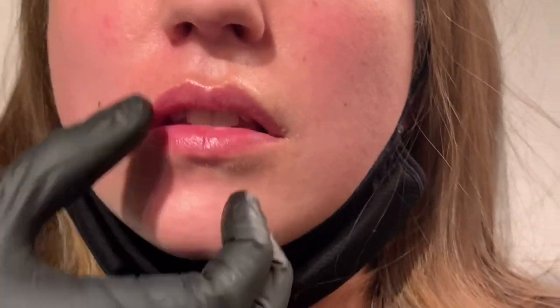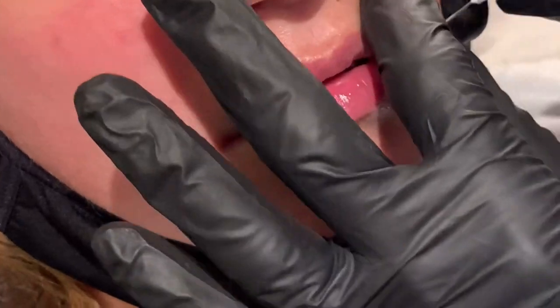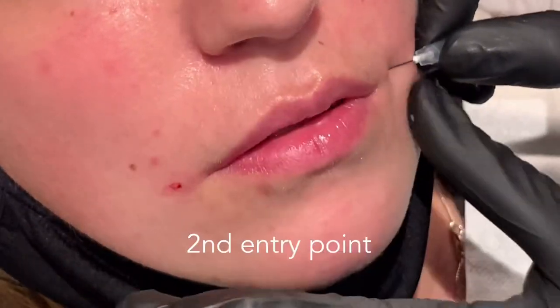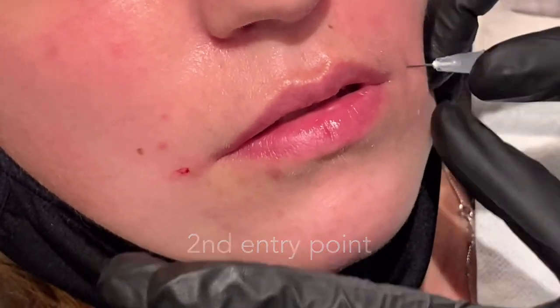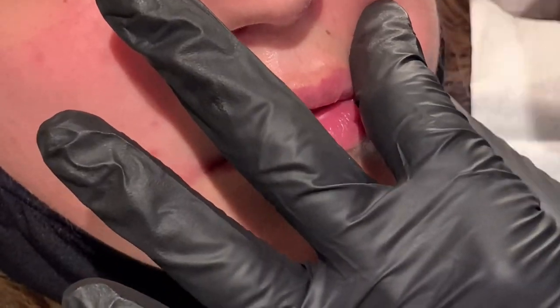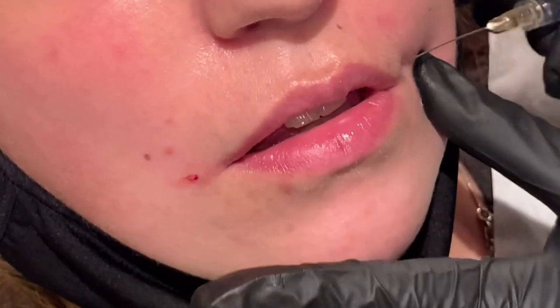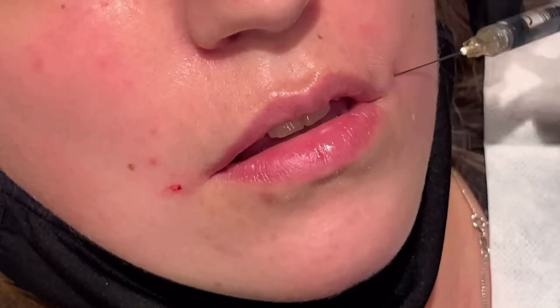The depth is really important here. Going too deep you're going to lose the product, and too superficially you're going to see the product. So you want to be in a subcutaneous plane — you don't want to see the color of the cannula, but you want to be just a bit deeper than that. Here I'm starting the other side, again within one centimeter of the oral commissure, and I do the exact same thing.